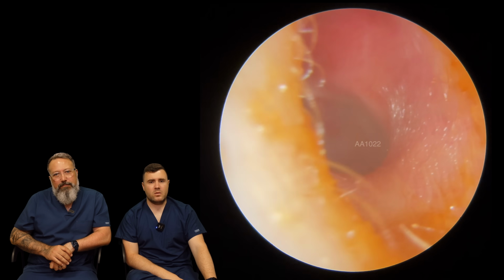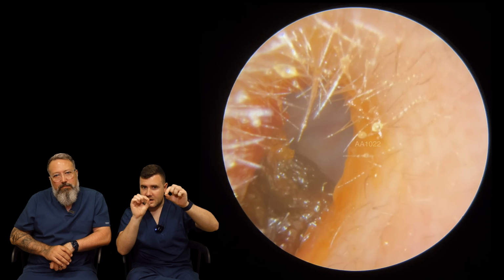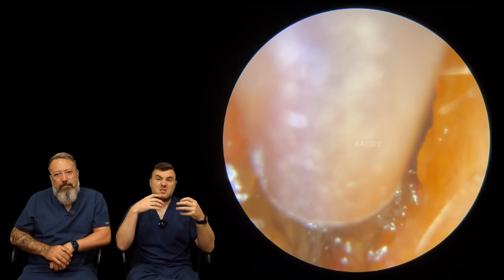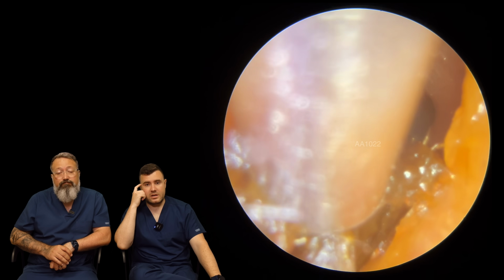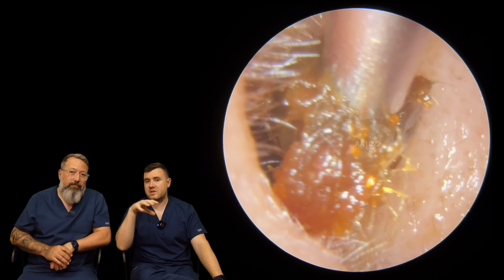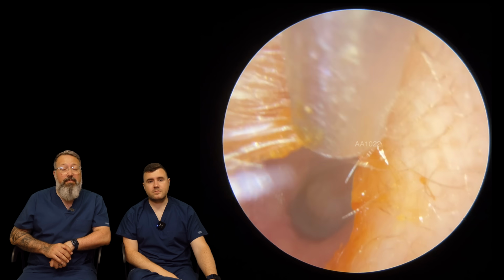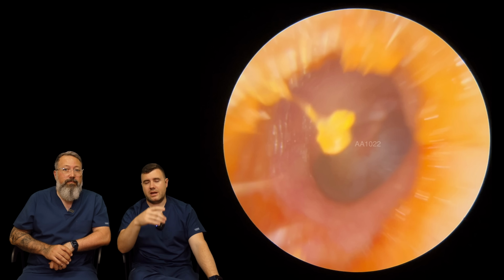So yeah, ear canal's already clear. Now a lot of the time when we get patients with middle ear effusion, if you're eagle-eyed, you might see little dark patches on the eardrum. There was a little bit of redness there as well, and that can be a sign of middle ear effusion, which is just fluid, or glue ear is another common name for it. They generally tend to clear themselves in the less severe cases. It may take a few weeks, usually about 6 to 8 weeks. They say sometimes up to 12 altogether, but more commonly it'll resolve usually about 6 weeks or so.